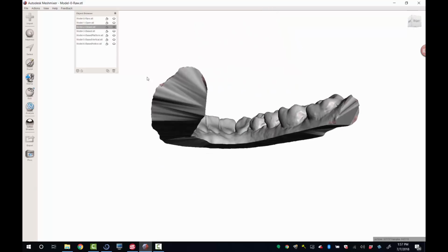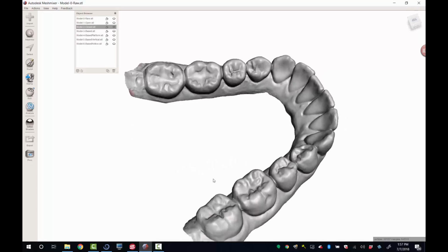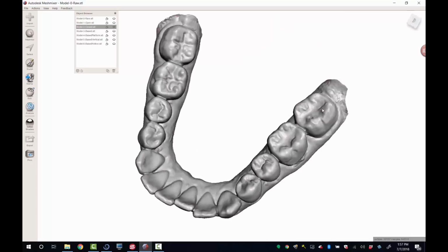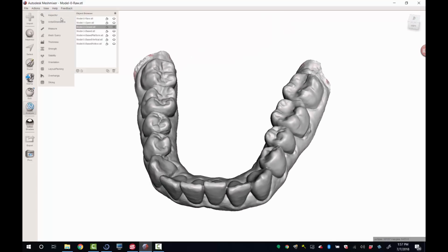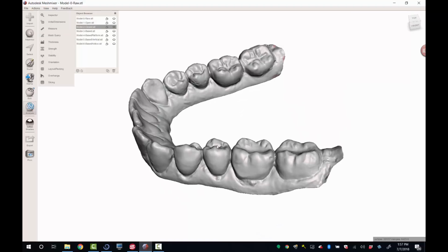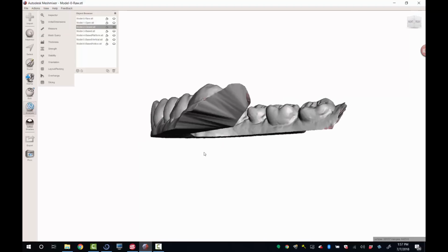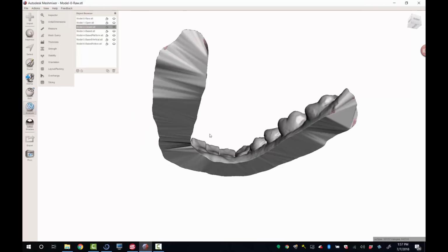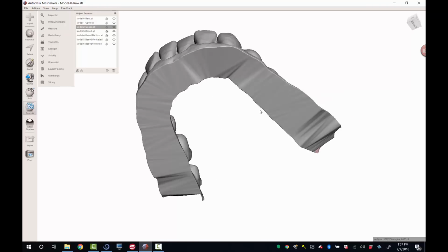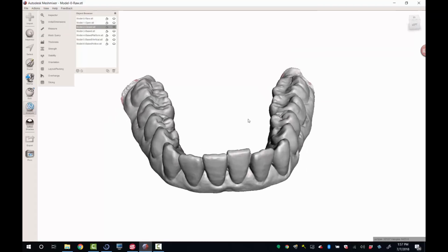Okay? Now, you'll have some little pink areas where essentially it's flipped inside out and whatnot. It's frustrating, but honestly, this is printable. It's ugly. It's like taking an impression of a patient, pouring it in stone, but never actually basing it. You have this awkward shape, and this one's actually pretty level. A lot of times they look much worse than this. You can imagine if it looked much worse, how hard it would be to make it stand or stick down on anything, because it would rock back and forth.